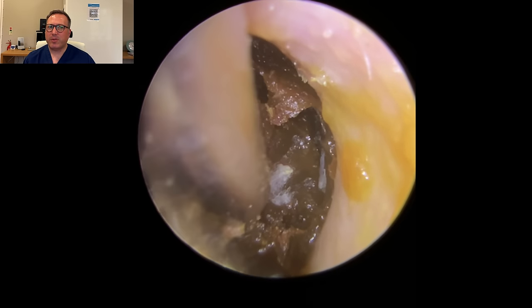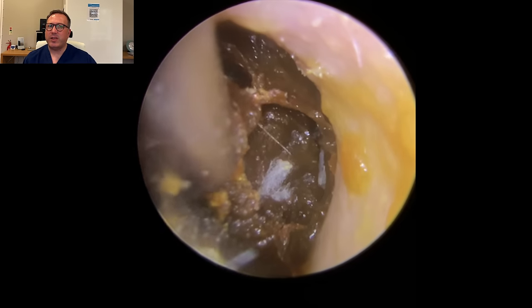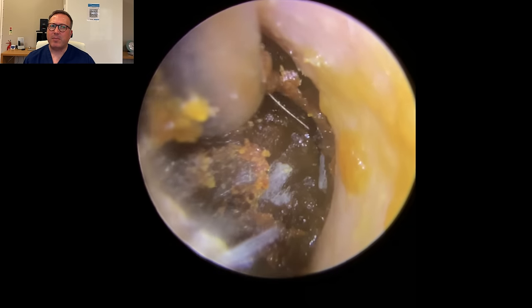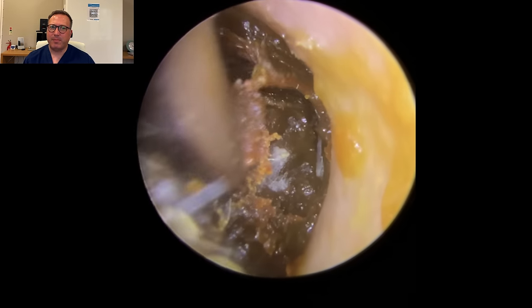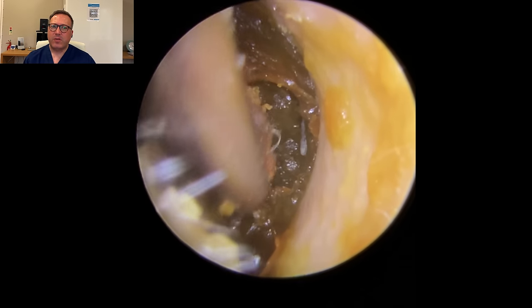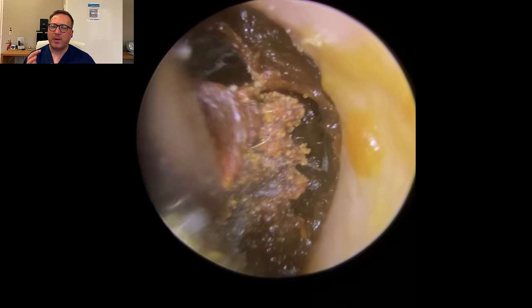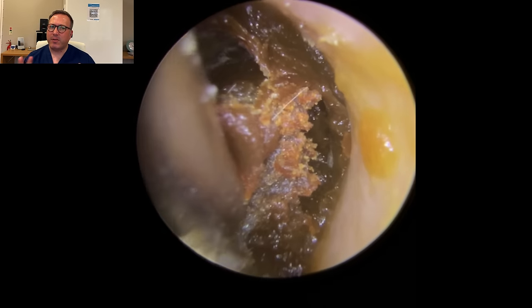We're just trying to get a grip on this next section. Much drier type wax just behind that front end where the drops haven't quite managed to reach. We're lifting, trying to unstick it as best we can, but it's very sticky wax around the outside edge - a very tacky feel to it. Really just trying to loosen as much of this as we can. This wax is really, really stubborn, it's not wanting to move easily. I'll explain that further on in the video.